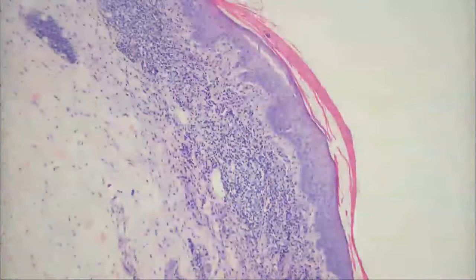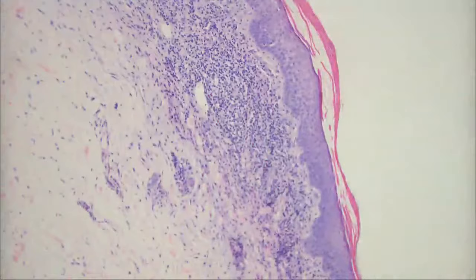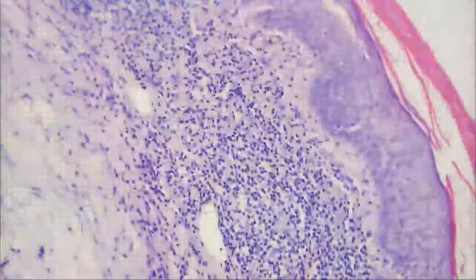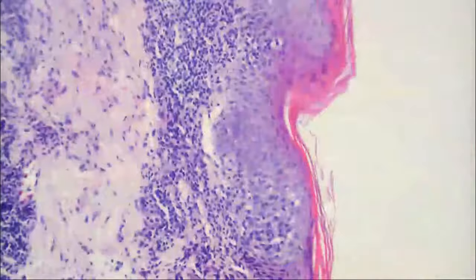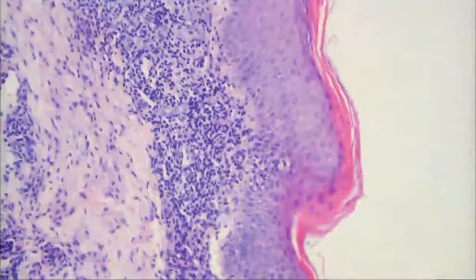Tinea can give you lots of different patterns. So spongiotic dermatitis, the band-like infiltrate, almost a lichenoid pattern like you noticed. It's got some eosinophils in it. You can get a granulomatous process. You can get follicular involvement with tinea. So lots of different patterns of tinea capitis, tinea corporis. What's the most common causative organism? I think the most common is T. rubrum. Good.